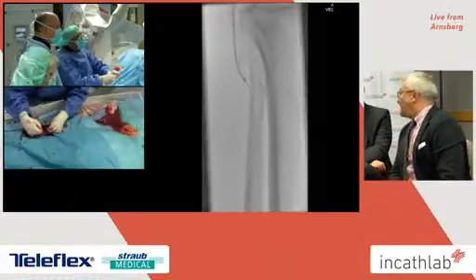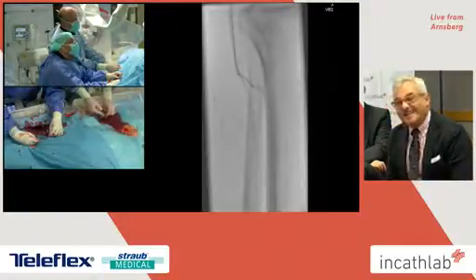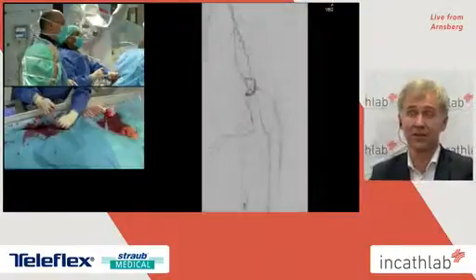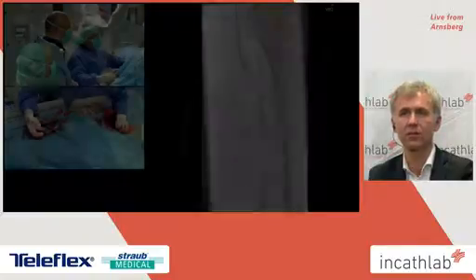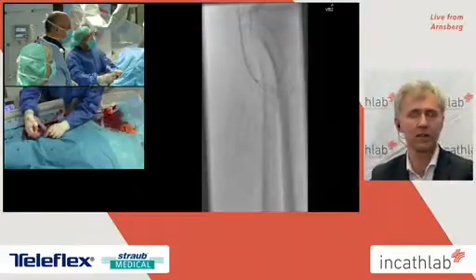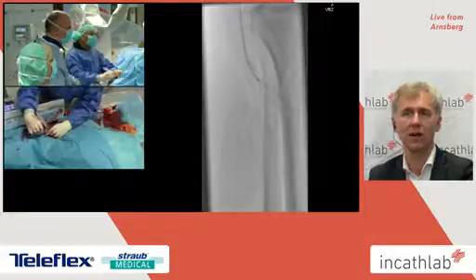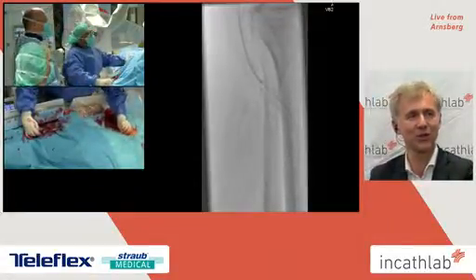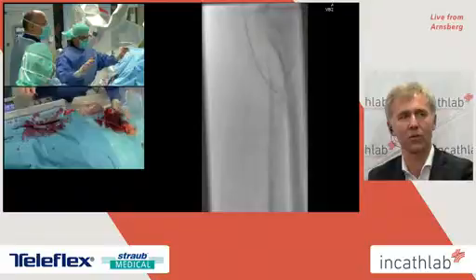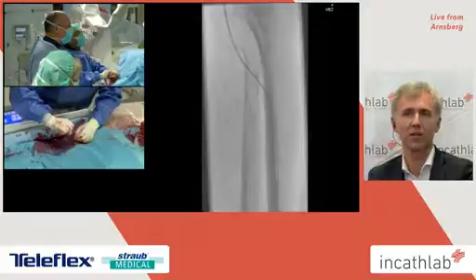Well, what do you think about the options for the bifurcated lesion, bifurcated vessels? So I think it's mostly really challenging. It is a little bit easier if you have a retrograde access, so then you can go with one antegrade and the other retrograde. So this may save the bifurcation lesion. But I've seen in some of your procedures during LINK that you sometimes go with a second catheter. As you did here, you have one wire and the other one is running on a Berenstein catheter, and you have two options, which is very elegant.